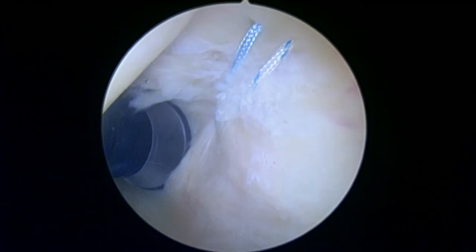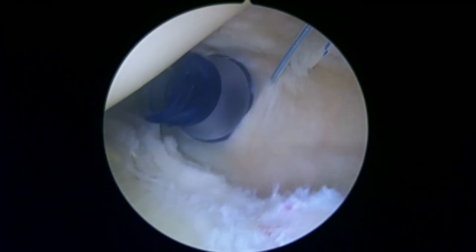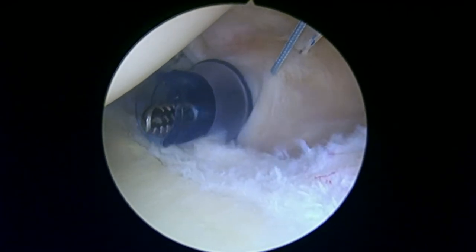Okay, here you can see we've passed our two ripstop stitches, and now we're going to go look in the subacromial space after we do a little bit more cleaning up back here on the labrum, okay?